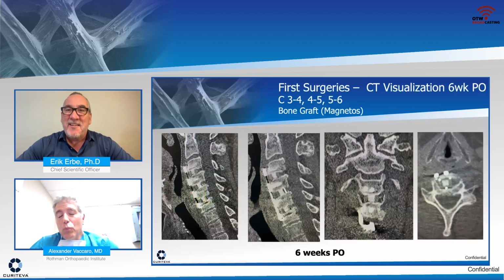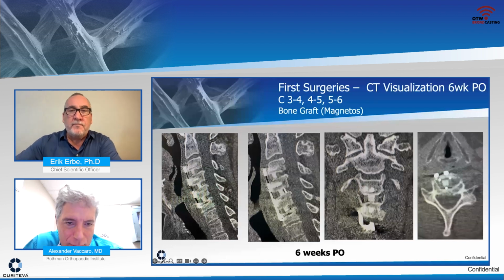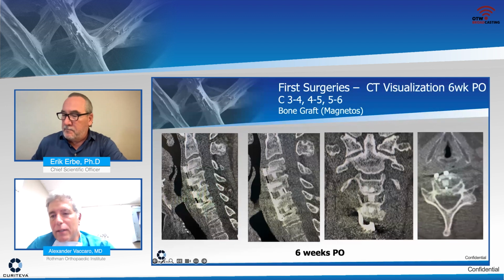Where I see a challenge is on the inferior graft host junction, and you can see it's nice and stable. You don't see any kyphosing, you don't see any significant settling. So this is a well-done procedure. And again, the surgeon has the confidence to be able to look at a lateral x-ray and say, yes, I can see what's going on. I'm confident that I have healing. And if you have non-healing, you can see it early. So if you have to intervene from a posterior approach to provide further stabilization, you have that option.